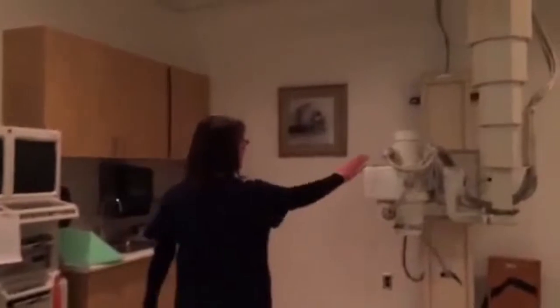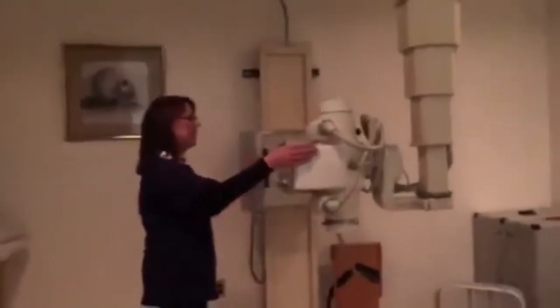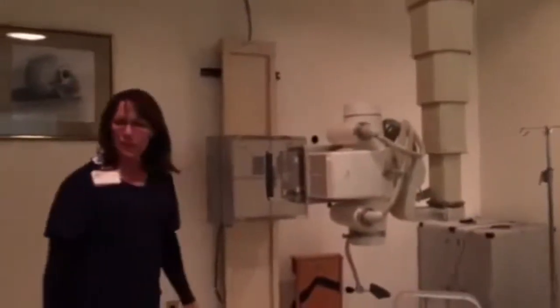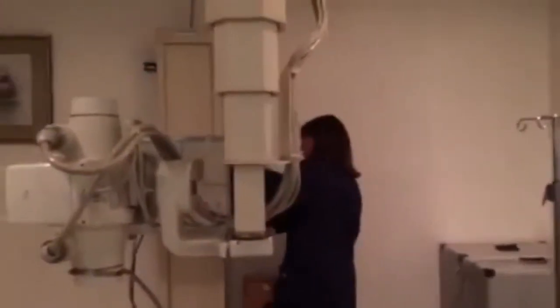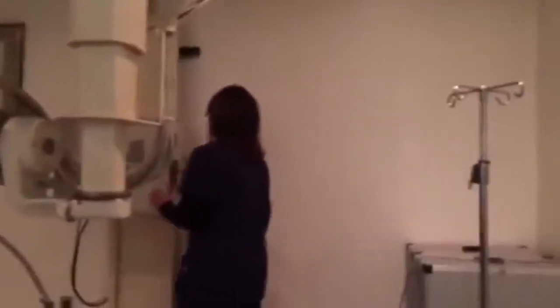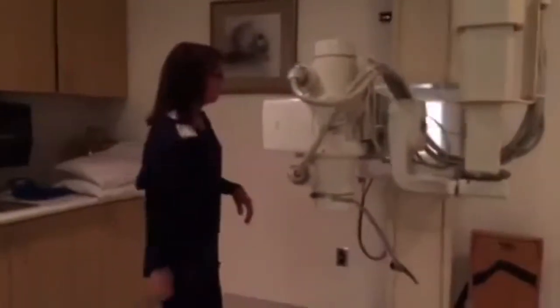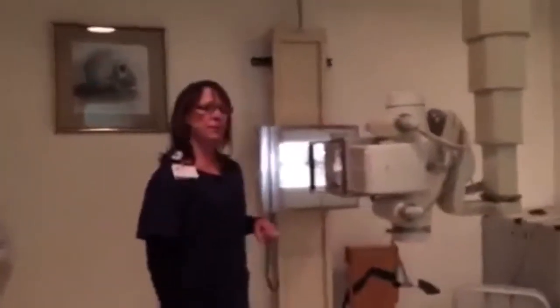Okay, I'm ready to set up my room. So my tube is detented at 40 inches, and my tube is also at a 90-degree perpendicular to the IR. I have a 10 by 12 cassette, let me go get my cassette. I'm going to insert it landscape into the wall bucky. I'm going to look at my collimation, and I'm ready to get my patient.